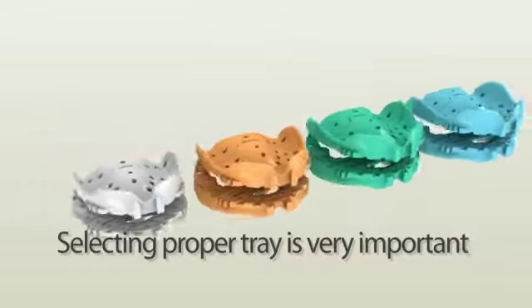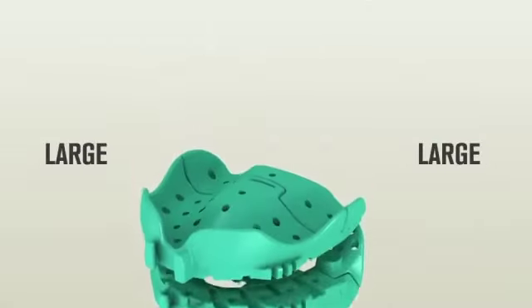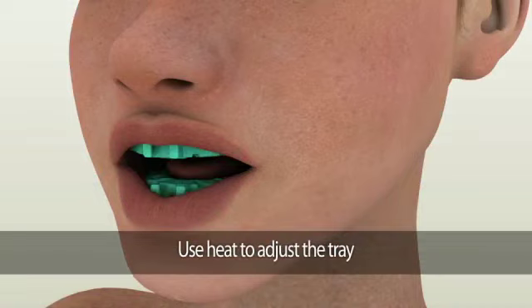Tray selection. Selecting the proper tray is very important. Depending on an individual patient's mouth, you could choose from small, medium, large to extra-large Pala digital denture trays. Always verify the tray size in a patient's mouth. In case a minor adjustment is needed, use heat to modify the shape of a Pala digital denture tray.